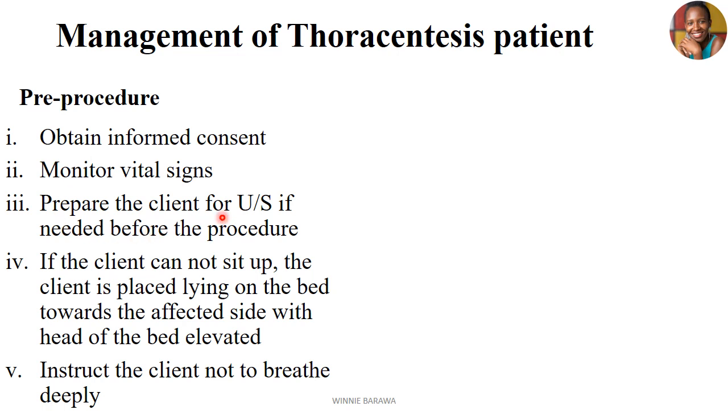If there is need for an ultrasound before the client goes for the thoracentesis procedure, it's normally advised that you do so. What the ultrasound does is assist us to know the extent of this fluid accumulation in the thorax and how the fluid has been accumulating all this time. But if it's not a must, you can always just go in having identified where the fluid accumulation has taken place already.